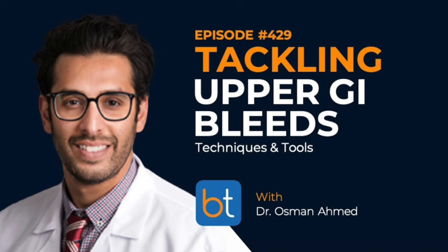What we like to consider, for most of us, quote unquote, bread and butter IR. So this is going to be your typical angiogram. For me, that means right femoral arterial access, 5 French sheath. Typically, we'll do a pigtail angiogram from the aorta, followed by selective catheterization of the celiac artery and then selective catheterization of the GDA, doing angiograms from each of those points, identifying hopefully a focal bleed that you can then super selectively catheterize and then proceed with embolization.